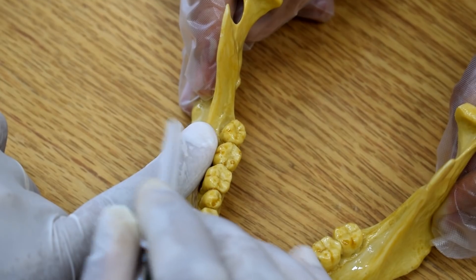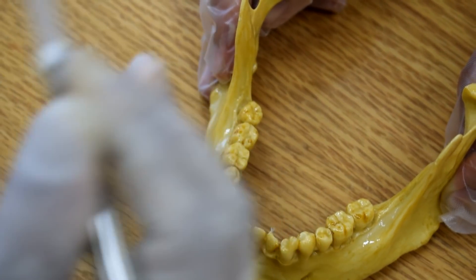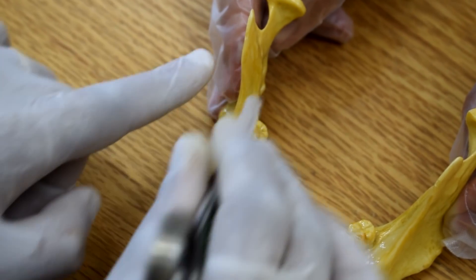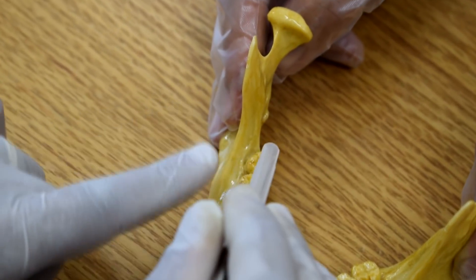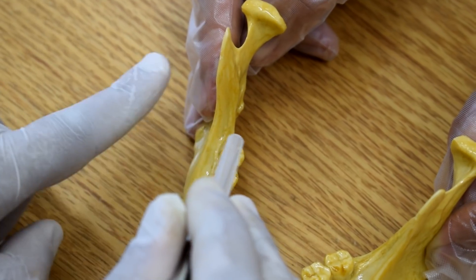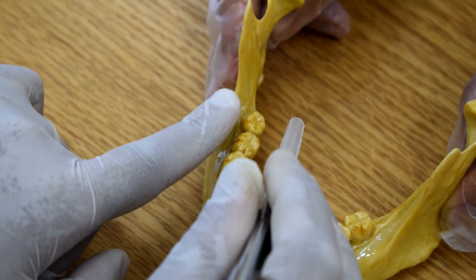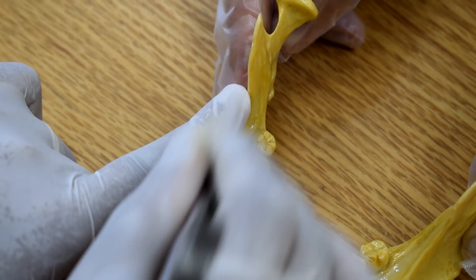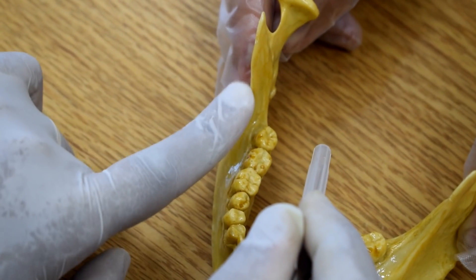You have to try to feel it by the most lateral area of your fingernail, here. In the patient's mouth there will be mucosa, there will be saliva, it will be more or less slippery, so while you are tracing, you will be directed laterally. If you have been directed laterally, you will reach the most concave area, but you will feel it by the most medial area of your finger bed, here.